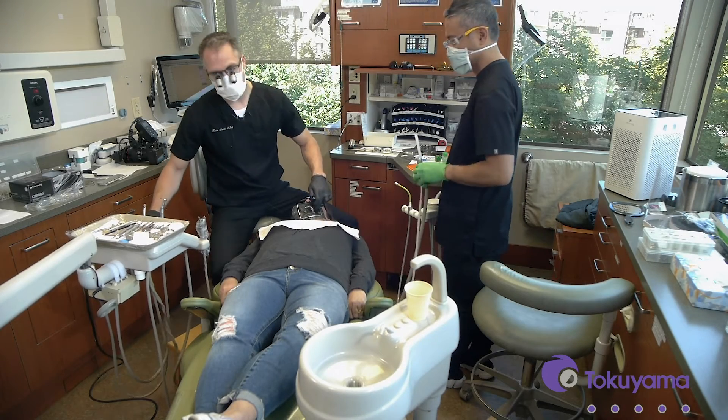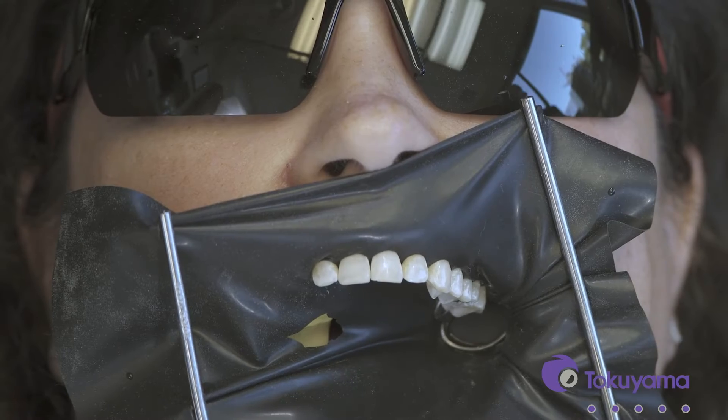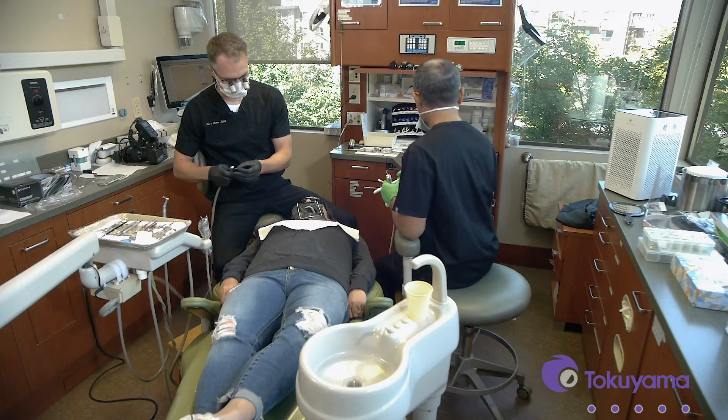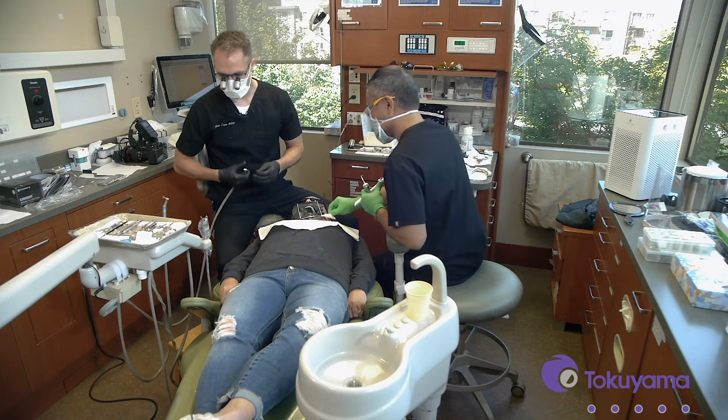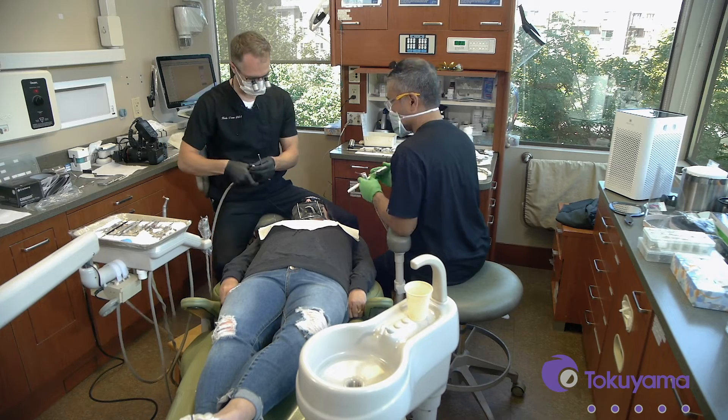Today we have tooth number 14, an MO amalgam that's been in there for about 20 years. Let's start by removing the existing restoration and then we'll see what coloration we're left with.